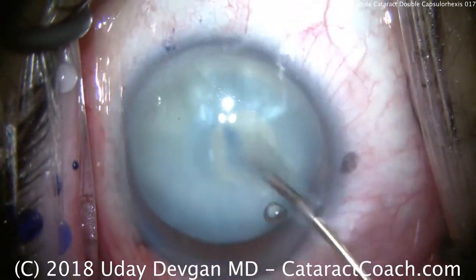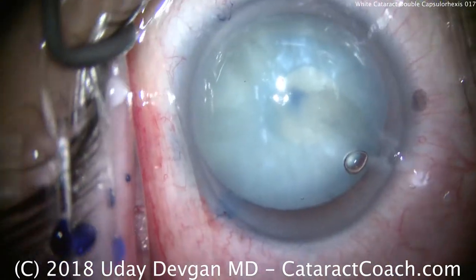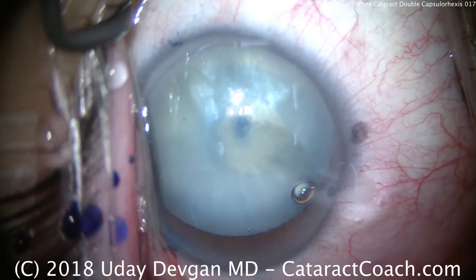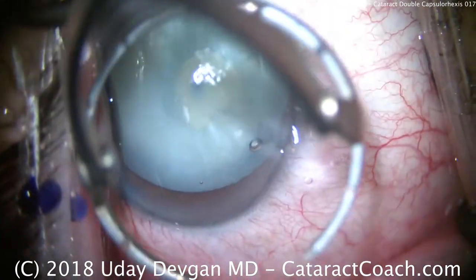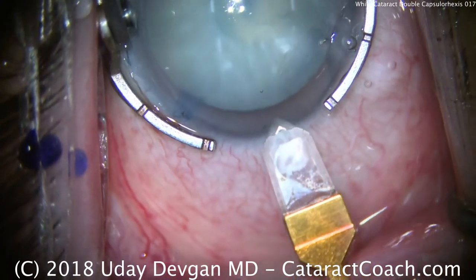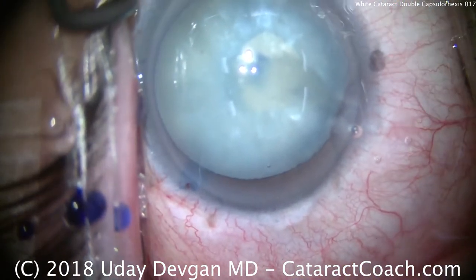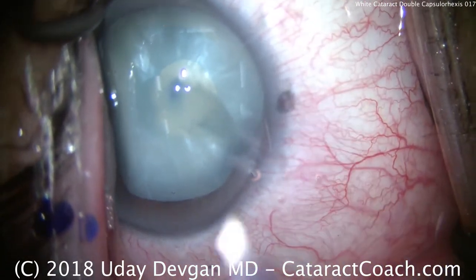That's okay. I'm now shaking the lens that's in the capsule, tilting it, twisting it, pushing on it to let any fluid come forwards. With no weak edges, that round small capsulorexis will allow us to depressurize the capsular bag without worrying about it radializing. Here's our main incision made with the diamond keratome. The small rexis allows us to prevent the Argentinian flag sign.